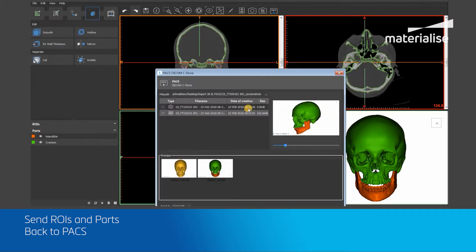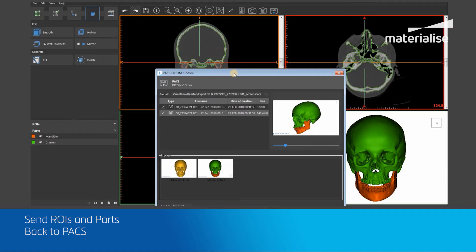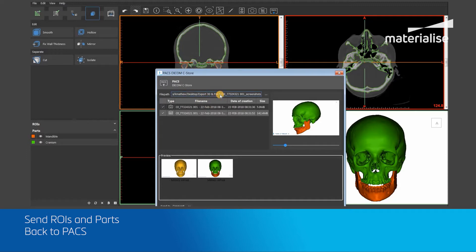This will open the PACS DICOM C-Store dialog box. Since I already exported my ROIs and parts, Mimics Imprint will automatically remember the export directory and provide you with the details of these 3D and 360 degree view screenshots.